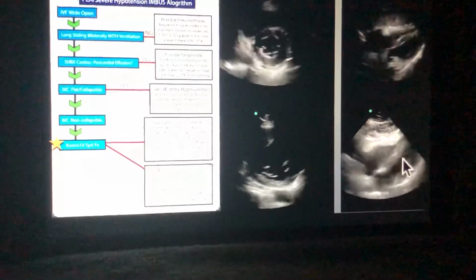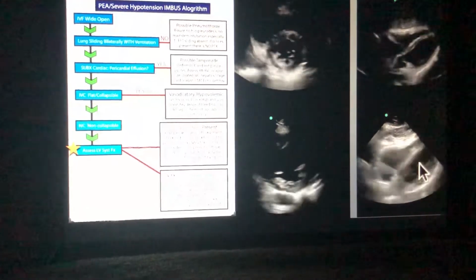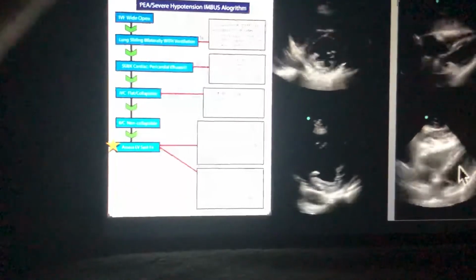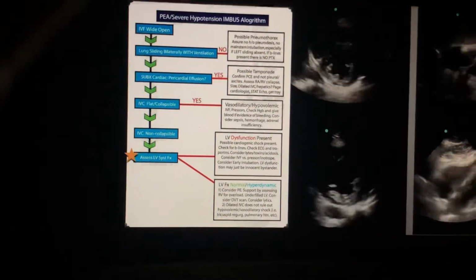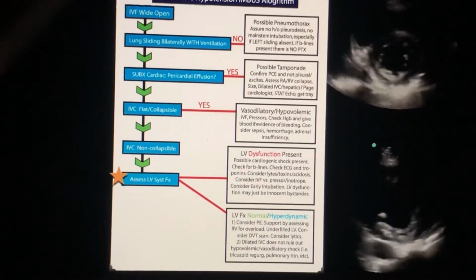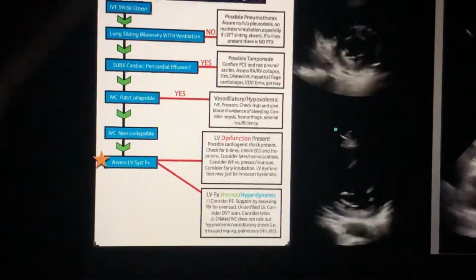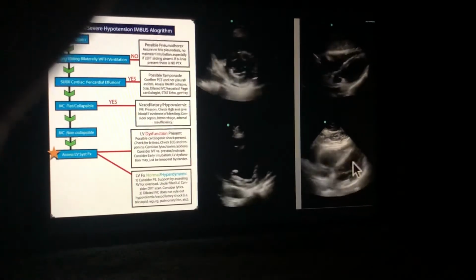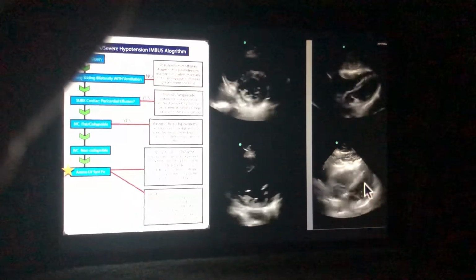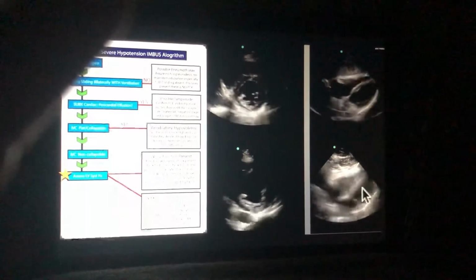That may benefit if this was a hypotensive patient with a flat inferior vena cava who was really hypotensive such that you couldn't feel a pulse and you called this PEA, sinus tach. This is probably just really hypotensive sinus tach. And this heart here would benefit almost for sure from a fluid bolus in these patients. So the spectrum of LV systolic function, when integrated with what we talked about previously, assessment of the right-sided pressures with the IVC, and then with lung findings from pulmonary edema, etc., can be a really valuable third piece to this assessment, but should come a little bit later.